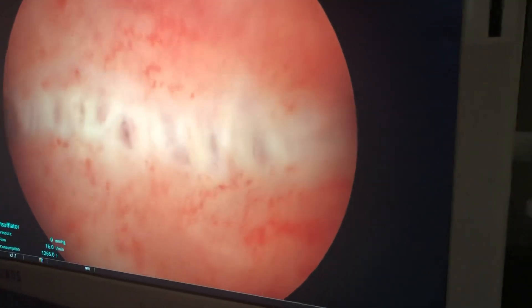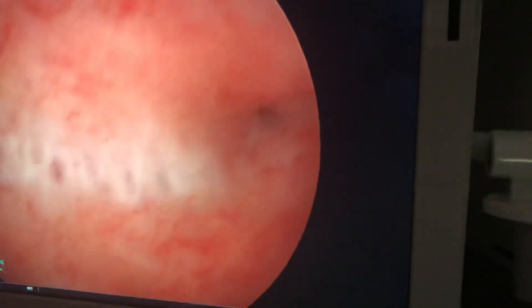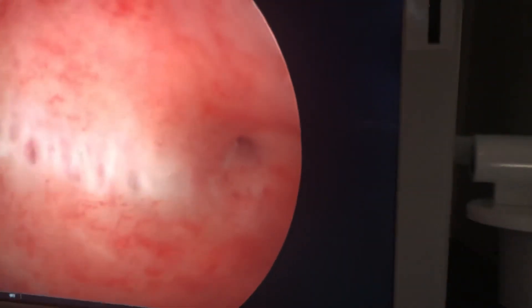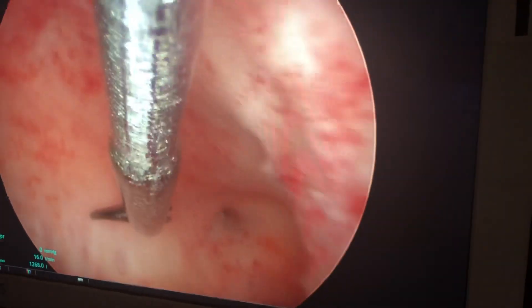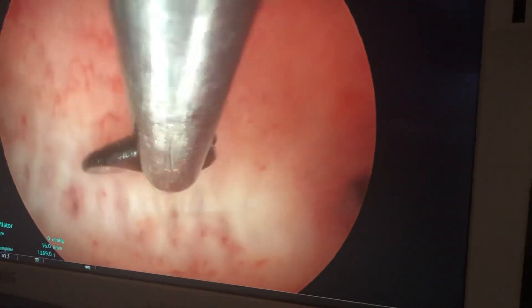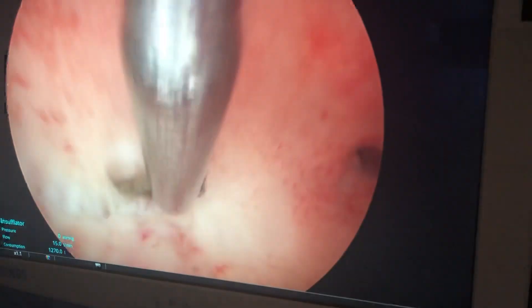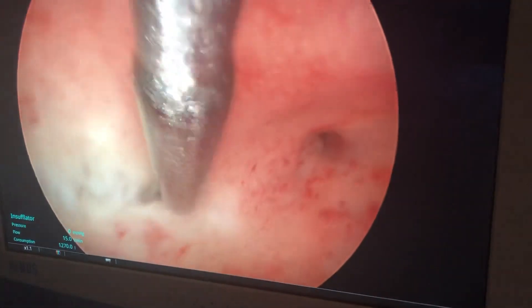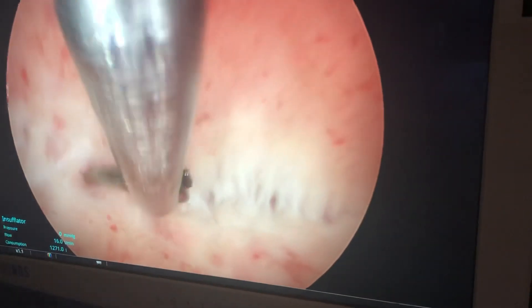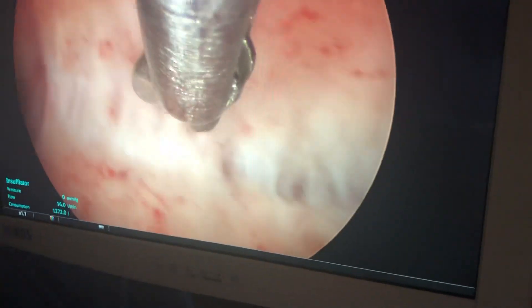Now Kim's going to give me some scissors. These are tiny little scissors. And we're going to use these scissors to cut this septum and give this uterus a normal shape. So I'm going to start here, and you can see us starting to cut. We want to cut in a line between the openings of the tubes, aiming between the two tubal ostia, or the openings.